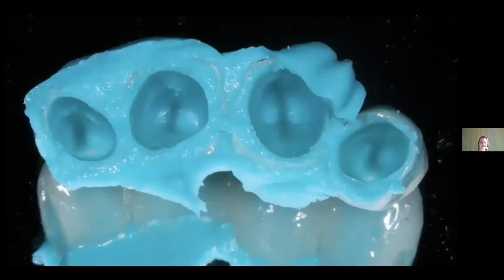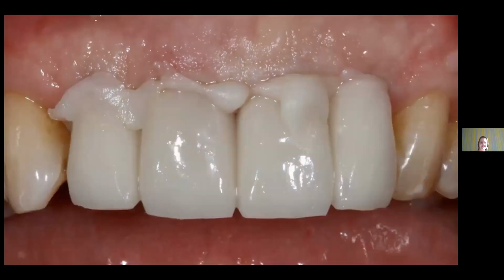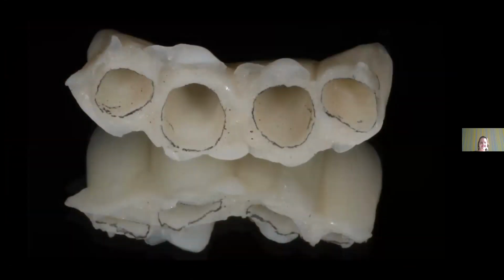We then take some high viscosity impression material, and we reline these just to see that they fit without touching the PMMA. And then we reline them. I've got a really cool trick on the next case that we'll have a look at as to these shell temps when you're communicating with your lab. And then we mark with a pencil into the gingival sulcus where we would like these to finish.